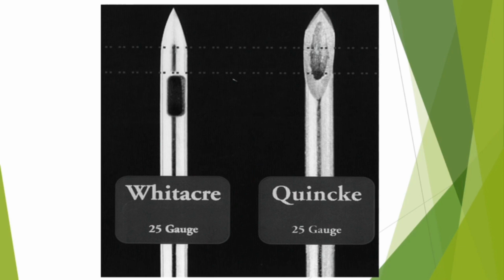Quincke's needle, that is the prototype for the sharp tip needles, on the other hand, has a sharp medium length beveled hollow needle with an injection. The needle causes more CSF loss, increasing the chance of PDPH. However, since the needle is cheap, it is still used in many parts of the world.